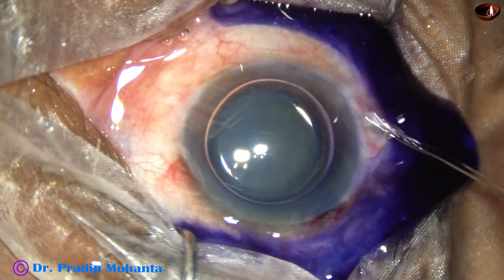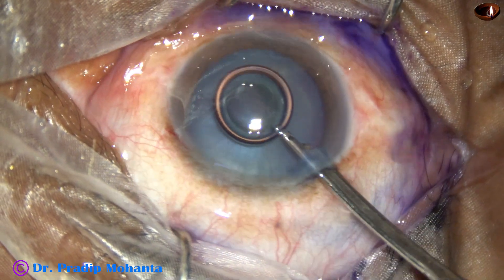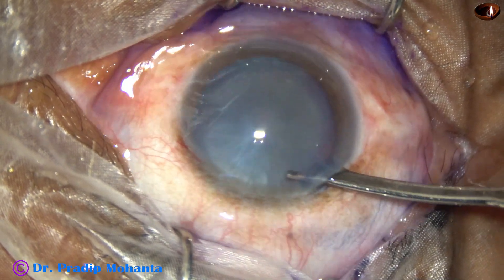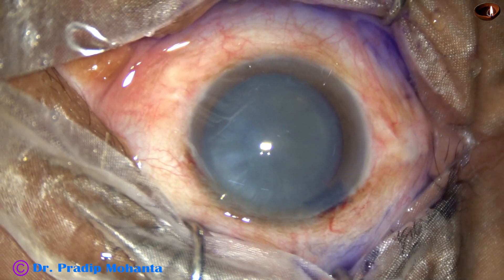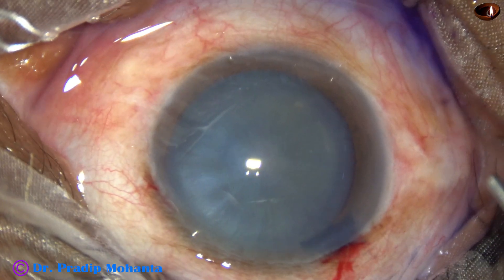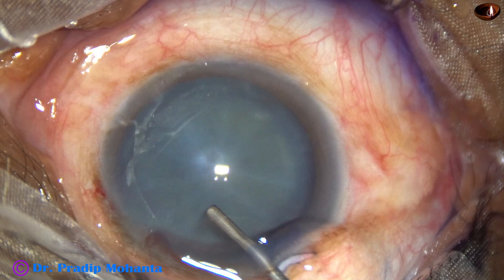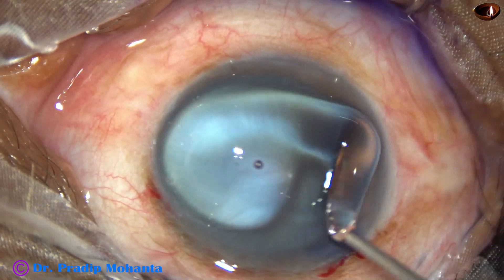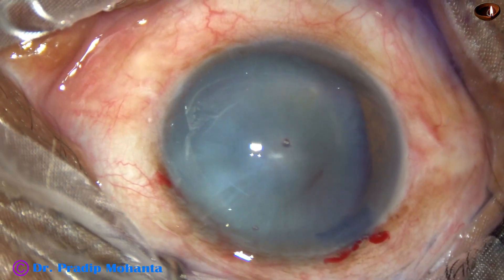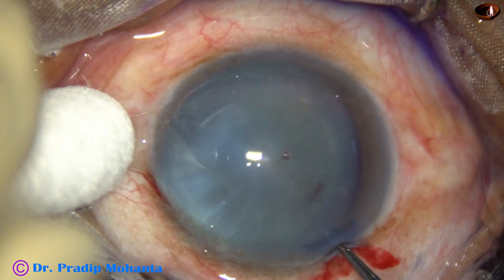This is adrenaline. Then the Trypan blue dye is washed out using a 23-gauge Simcoe and BSS. The anterior chamber is filled up with 2% hydroxypropylmethylcellulose. The ocular surface is covered with HPMC and visibility becomes better.